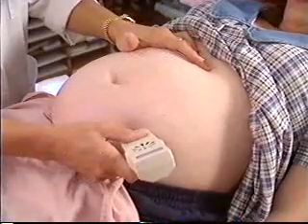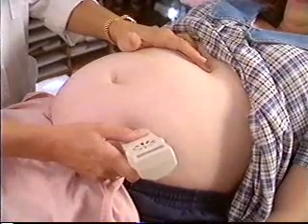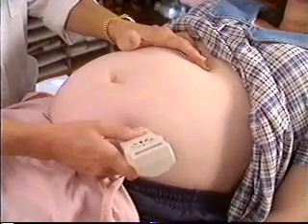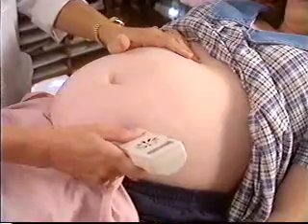For a toned fetus in the vertex position, you can locate the fetal heart tones below the umbilicus on either side of the midline, the left or right lower quadrant, LLQ or RLQ, depending on the lie. For a fetus in the posterior position, fetal heart tones are close to the midline or in the flank area, in which case you will be listening to the fetal chest. To be sure and get the gel off.